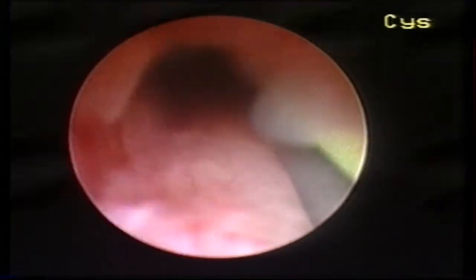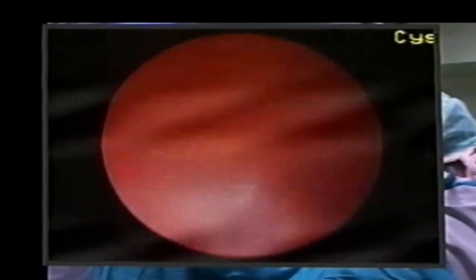The endo-ureterotomy will be performed on the medial aspect of the ureter, since there is only the bladder there. A 5 French electrode is introduced through the ureteroscope. A 30-watt cutting current is used and the endo-ureterotomy begins above the stricture and progresses downward.